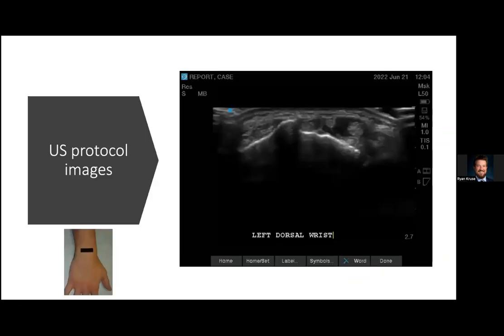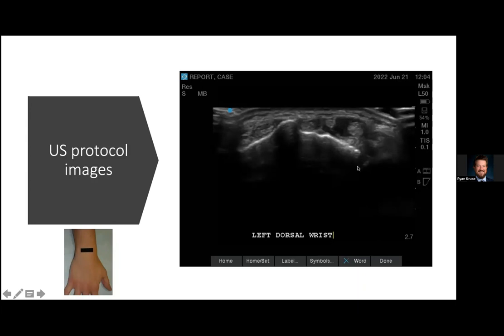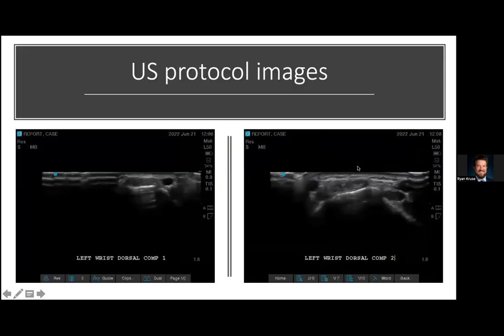Going through how to obtain these protocol images — this little diagram shows your location. You can use a towel roll to help with orientation. Home base: Lister's tubercle off the distal radius is going to separate your third and second compartments. That's really your home shot to know you're in the right orientation. From there, you can start to evaluate the rest of your compartments. With dot radial on the right, we have our second, third, and you can actually see part of the fourth. Not fluid, but actually just low-lying muscle belly here.